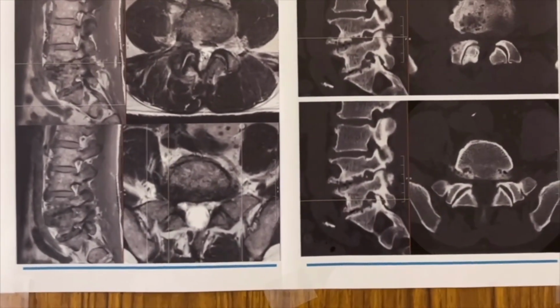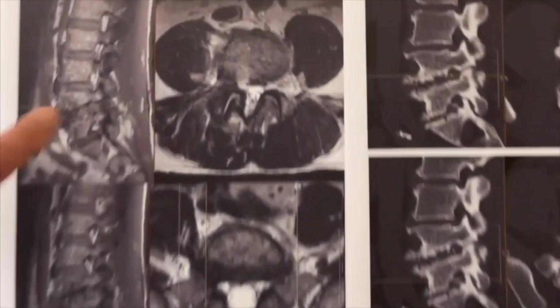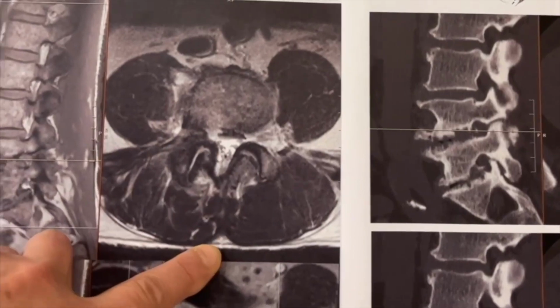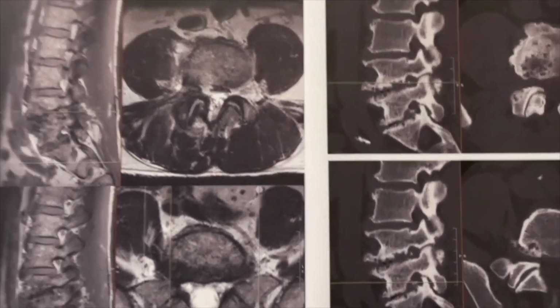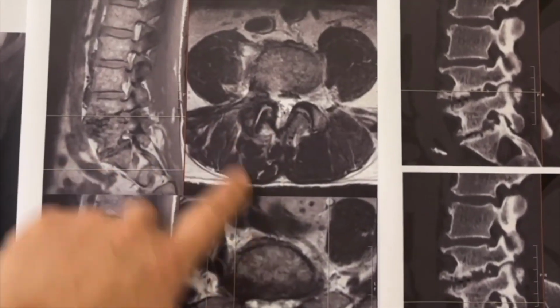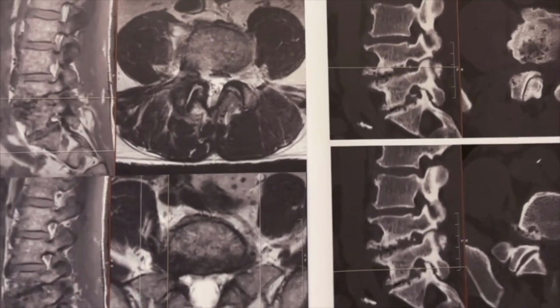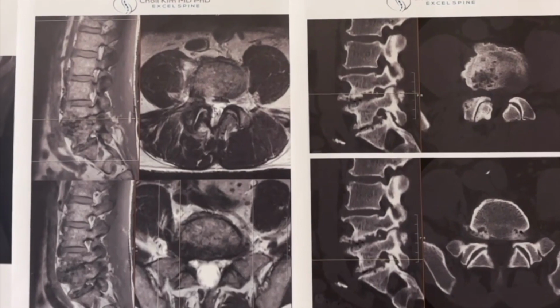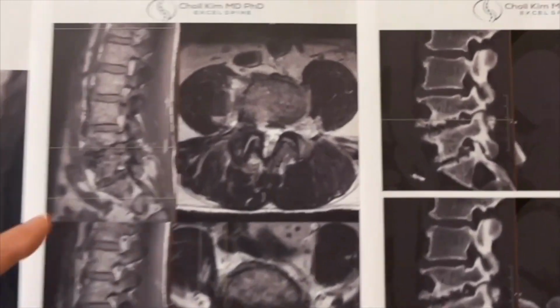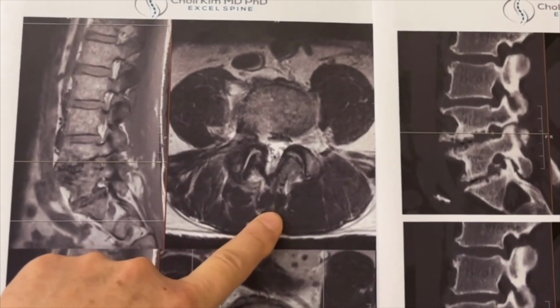And we want to do it all minimally invasively so that we do not disrupt the function of the back muscles. Not only do you not want to weaken them, but as a professional golfer, those back muscles need to be very coordinated. So you do not want to crush the muscle. You don't want to detach the muscle. You do not want to remove too much bone because that affects stability. And so using the laser endoscopic technique, we can make a little poke hole, come at it in a paraspinal fashion and avoid injuring the tendons to the important muscle called the multifidus.